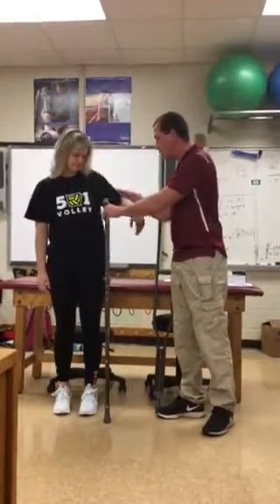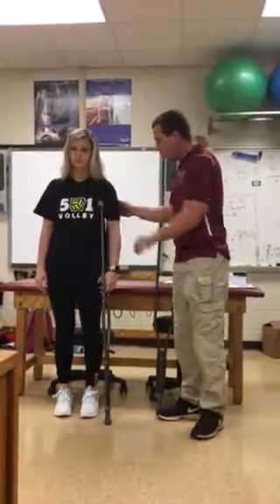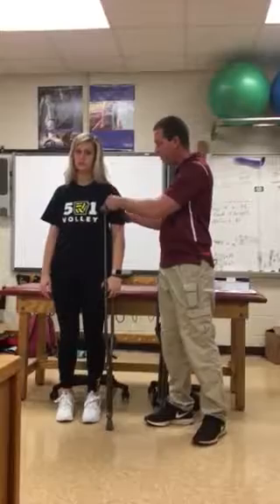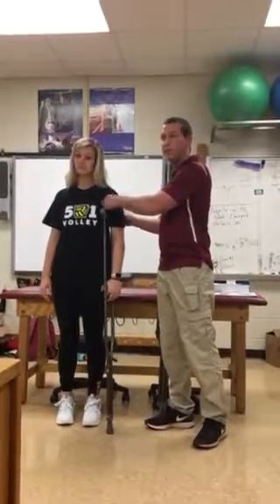So 3 inches forward, 2 inches to the side, and then you're going to put it under their arm. With them standing normally in this position, you should have about 2 to 3 finger widths in their axillary area.